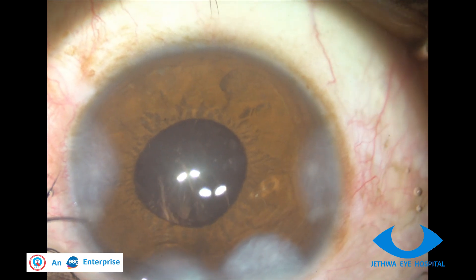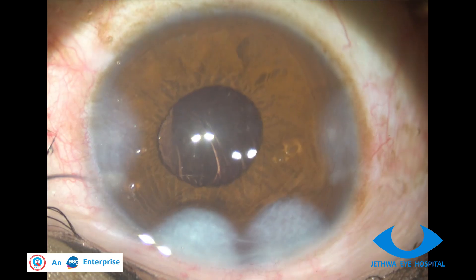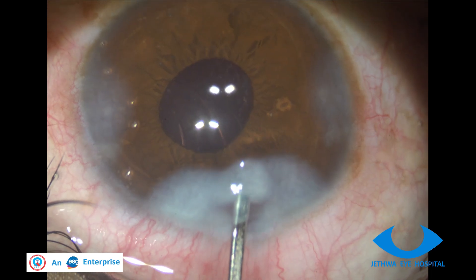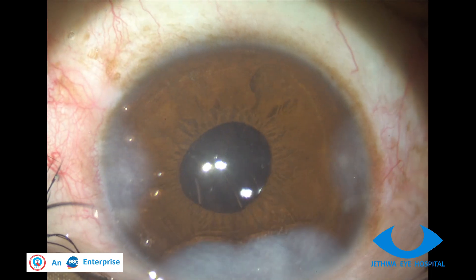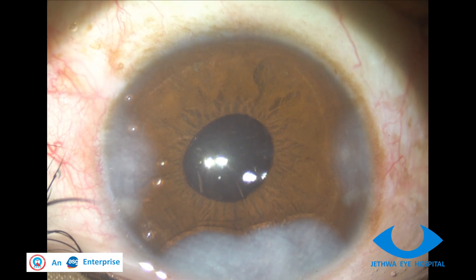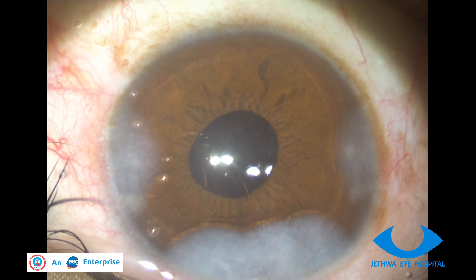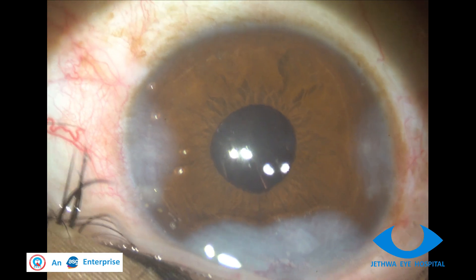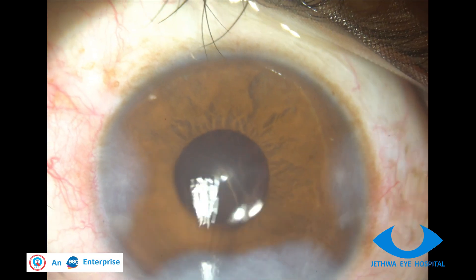If required, additional hydration is done at the main port. You can see the pupil is getting smaller and smaller, and there is no notch in the round pupil, suggesting that there is no vitreous in the anterior chamber.